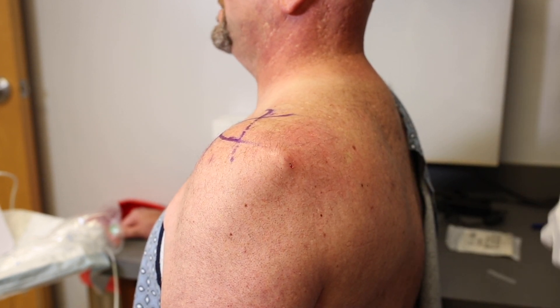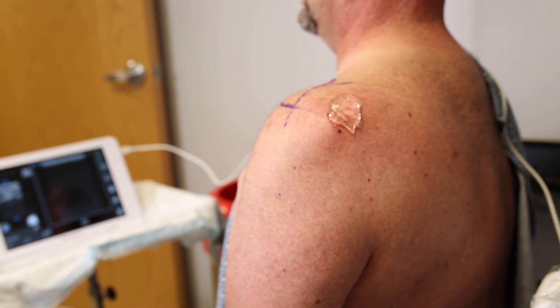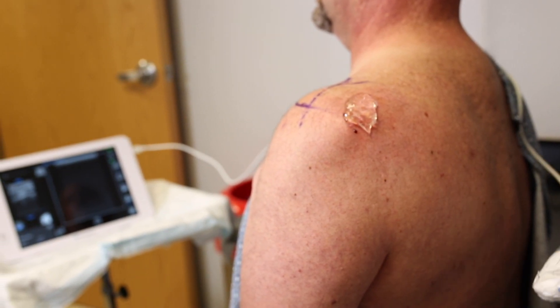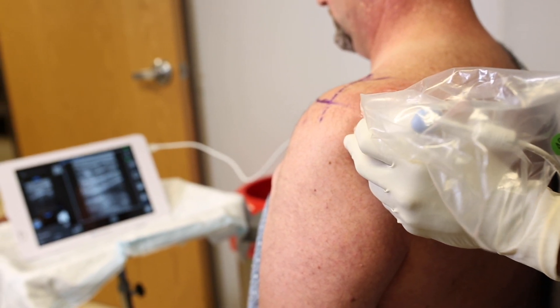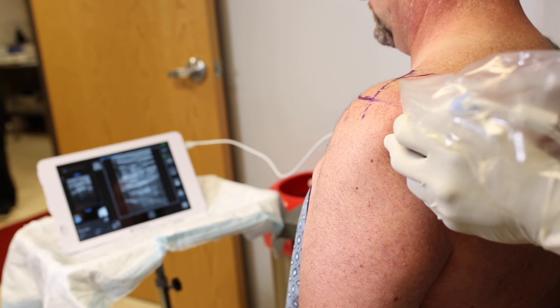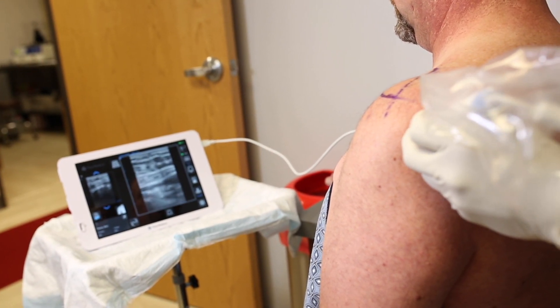We're using a transducer-friendly type of prep that does not have alcohol in it. You can see we're using a transducer cover — this is a shorter cover, not the three or four foot long cover that becomes unwieldy, but a nice sterile transducer cover that protects the transducer as much as it protects the patient.